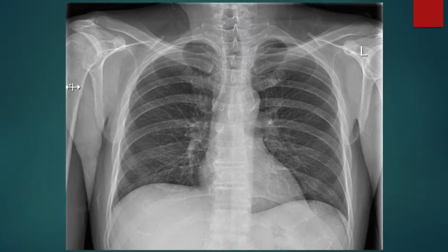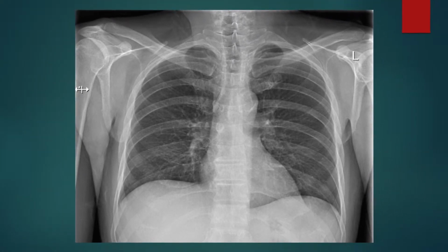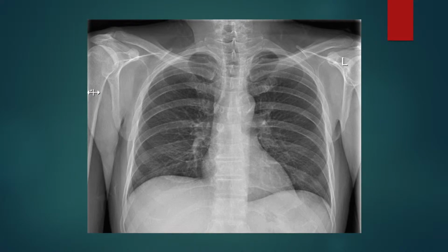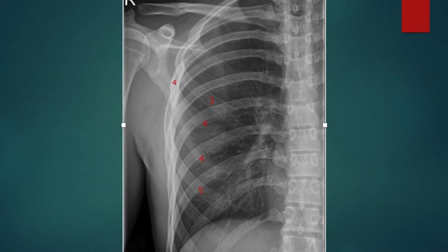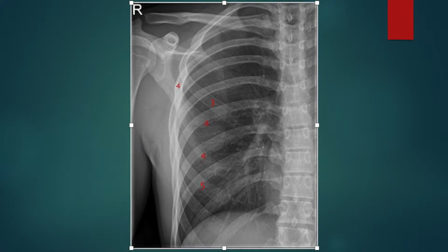So some facilities might have you do an AP or a PA chest to go along with the ribs protocol. The important thing to remember is that even though that is included, you still want to do a unilateral view of the affected ribs, whether they are anterior or posterior ribs. In the clinical world, this is what we would call single shot.